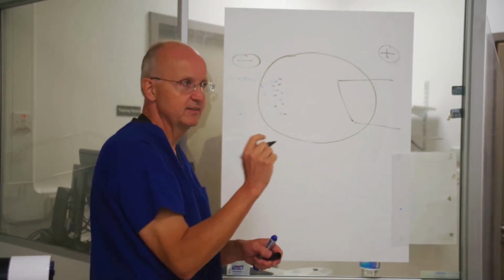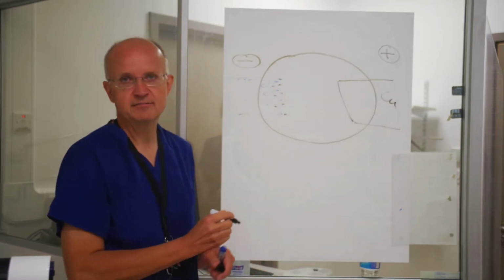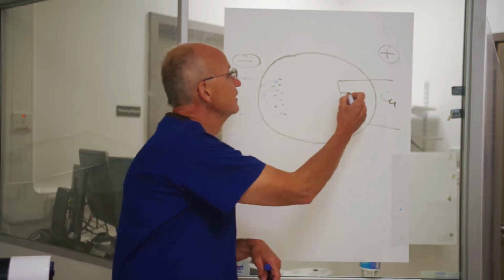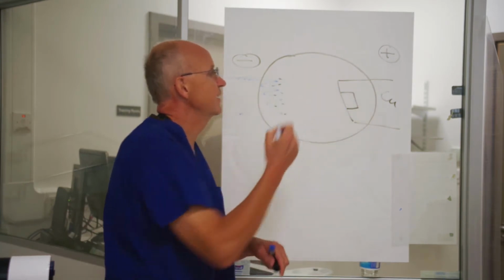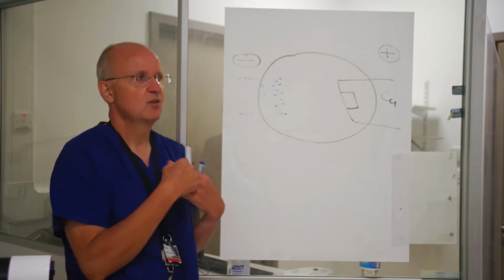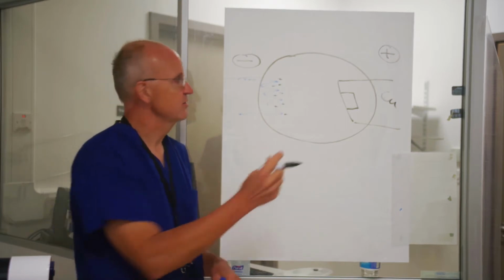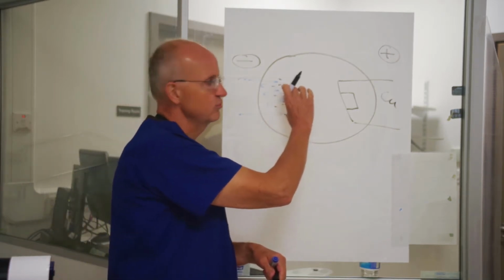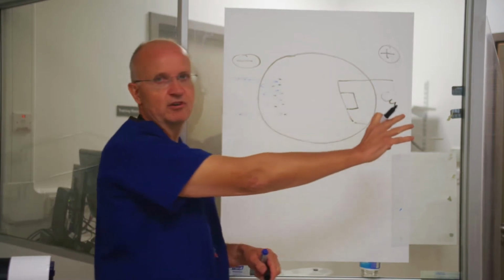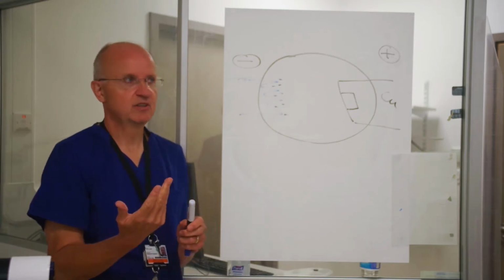Now, as Sarah rightly said, the anode has a huge amount of copper in it, but it also has a target, which Carlin mentioned, which sits within there. Now, what happens with all this? Why do we have a target? What is that target going to do? So what we are going to try and do is to focus somehow these electrons and bring them over here onto this target, and by accelerating them across and then rapidly decelerating there, that's how we get the X-ray production.